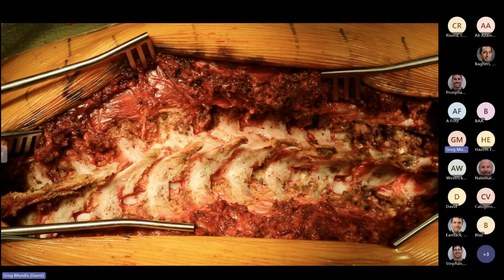And so the techs need to know, if they're the ones preparing the bone, or if it's residents preparing the bone, they need to be aware that you have to take that cartilage off, because cartilage isn't going to do much for bone fusion.